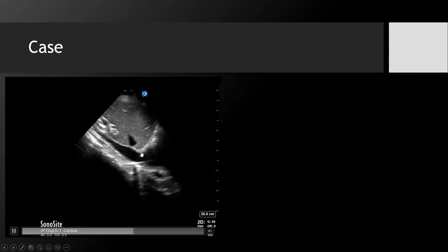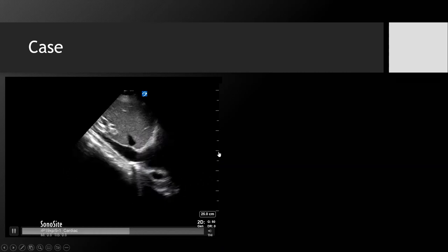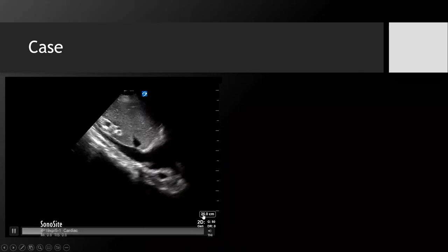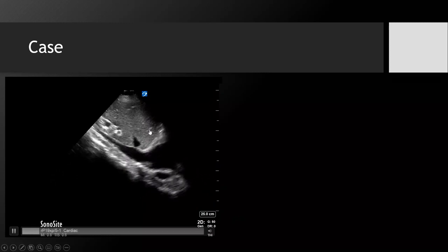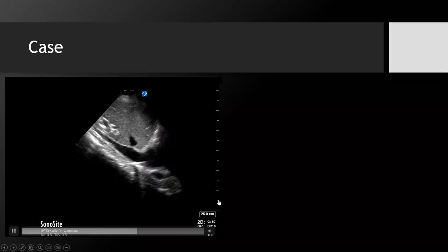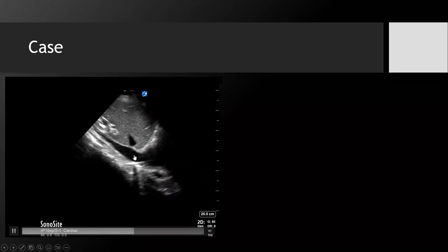Finally, you're looking at the IVC here. It's not super plump. It's not super large. This right here is about probably 2 centimeters, so actually could be. I should correct myself. This is 25 centimeters deep, and one of the things I always remind people not to be fooled with is that when you're very deep, IVC could look small if you don't measure it, but this is 25 centimeters. Each of these distances is probably 2 centimeters, so that could very easily be over 2 centimeters.